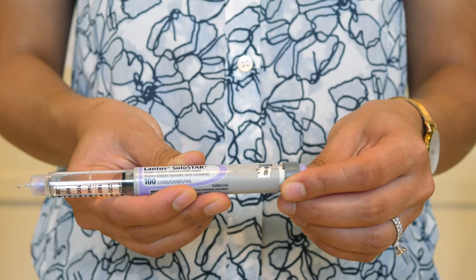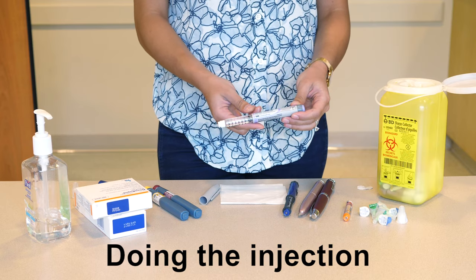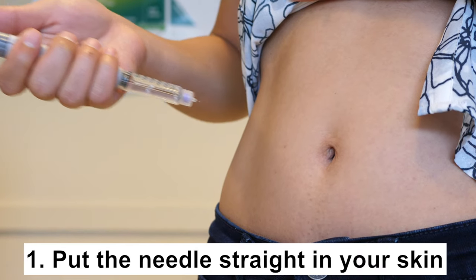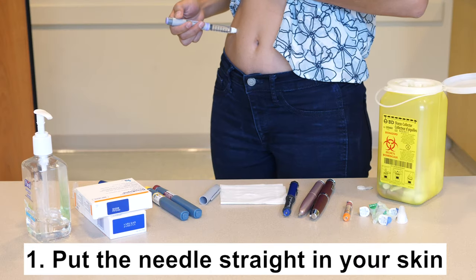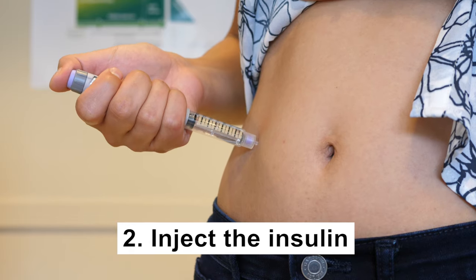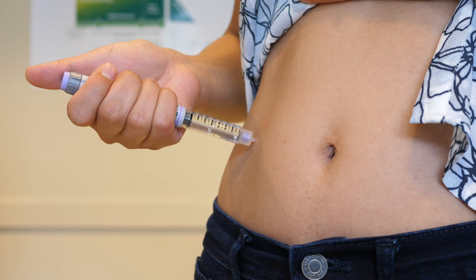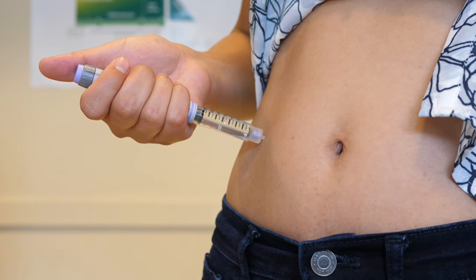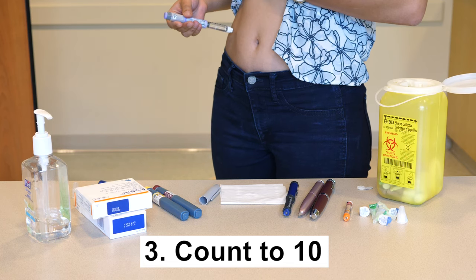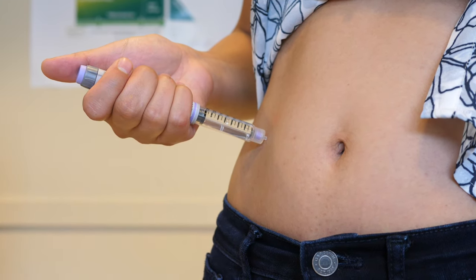Dial up the dose of insulin you will inject. Put the needle into your skin straight in, not at an angle. If you are very thin, you might need to pinch your skin and lift it up to prevent the injection from going into the muscle. Inject the insulin by pushing the button at the bottom of the pen all the way in. Check to make sure the dial goes to zero. Count to ten while leaving the needle in place so that you will get all of the insulin. You will know if you didn't leave the needle in long enough if your skin is wet or you smell insulin.